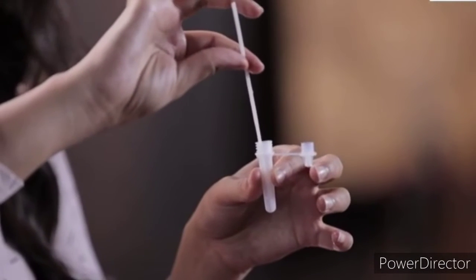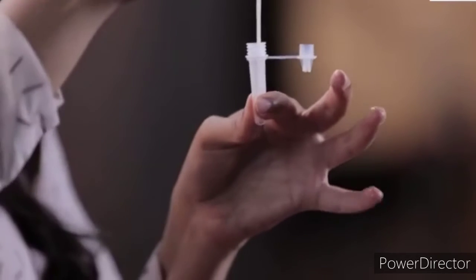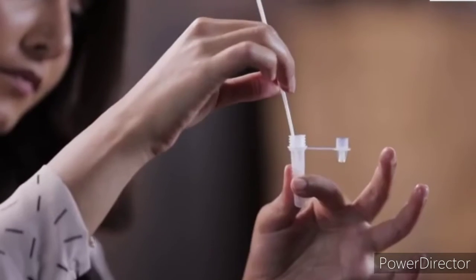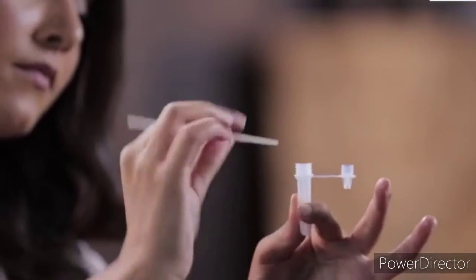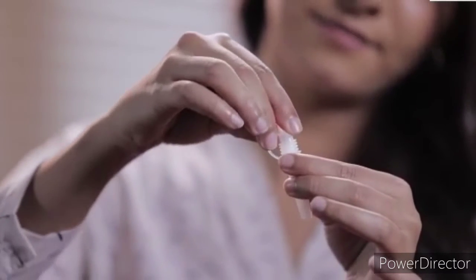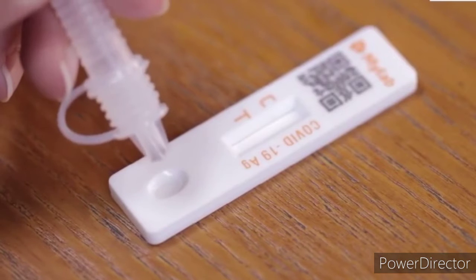Dip the nasal swab sample in the pre-filled extraction tube. Pinch the tube at the bottom and swirl the nasal swab well. Make sure the swab is immersed in the liquid. Find the breakpoint and break the swab. Cover the tube with the nozzle cap and tighten it. Take the test card and add two full drops into the well by pressing the tube.